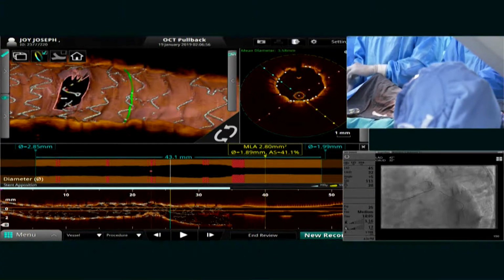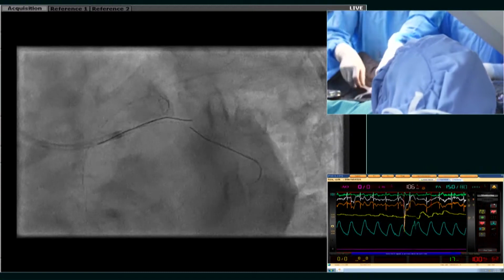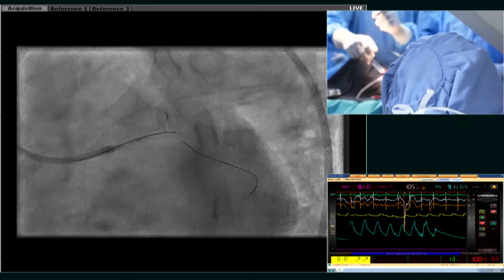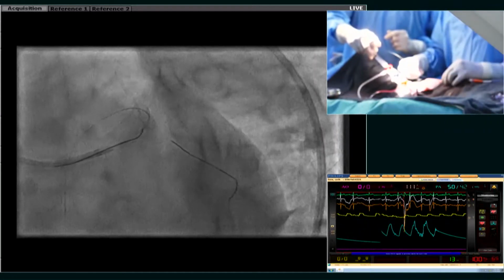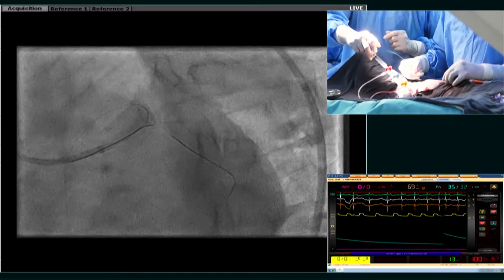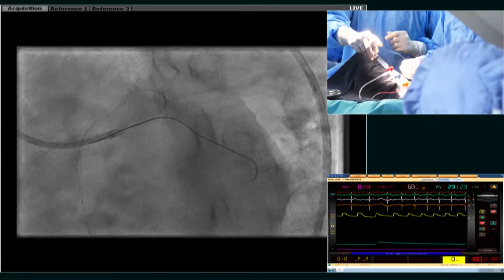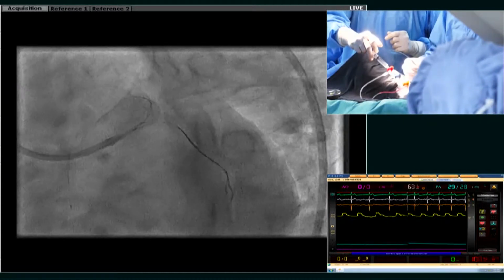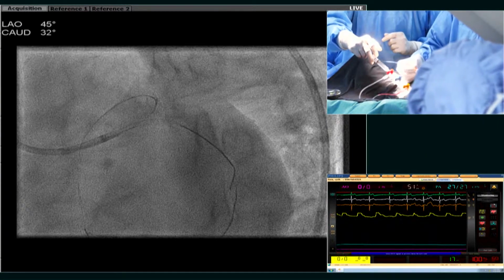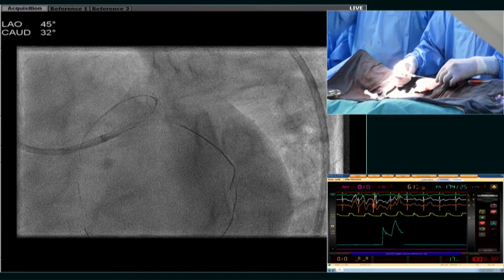Shall we see the angiogram? The LAO quadrant? One second. What I'm doing is, let's go back. I'm just trying to do a distal cross here, and try and confirm it on the OCT that it's a distal cross, because only with a distal cross will I be able to then go and do a kiss. So I have tried and crossed it distally, and I will confirm that again with an OCT.